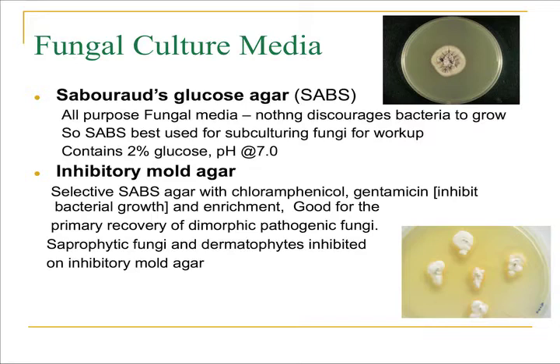The only problem with Sabouraud's is it does not discourage the growth of bacteria. So if you have a specimen that is loaded with both bacteria but some yeast, the bacteria could actually overgrow the yeast. So that's one of the bad things about Sabouraud's. Oftentimes this media is used more for subculturing and working up of organisms more than it is the initial isolation from patient specimens. It contains 2% glucose and the pH is around 7.